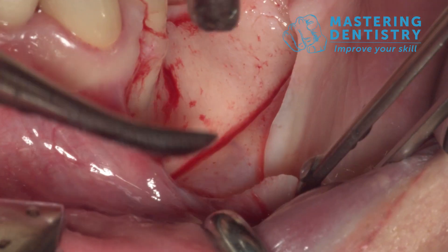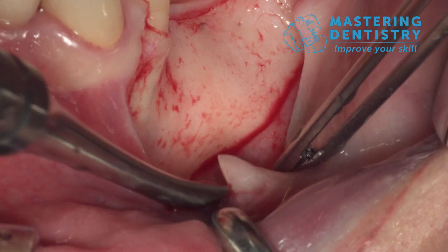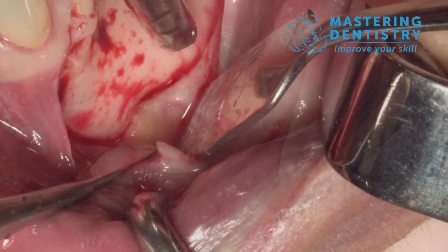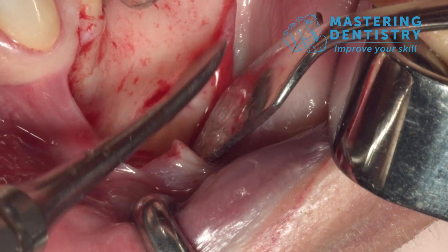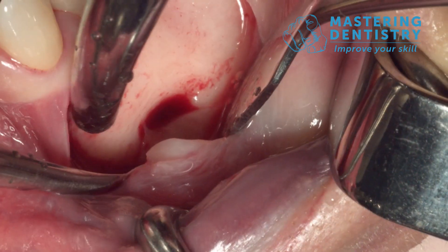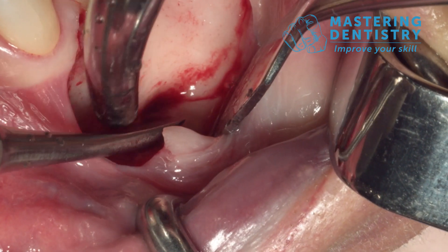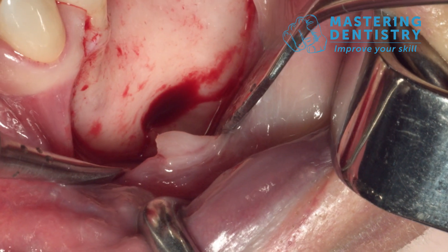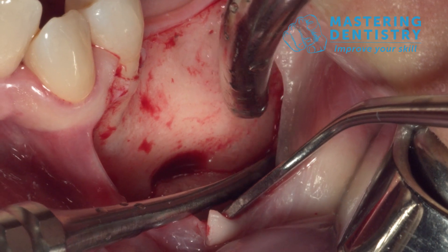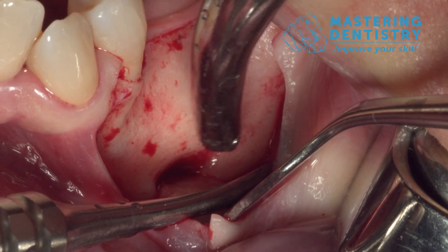You start to see the mental nerve, and when you see it, you start from mesial and then go distal without pushing on the nerve. You can see the nerve is whole and safe underneath the periosteum — the nerve has not been damaged and it's safe underneath the periosteum.